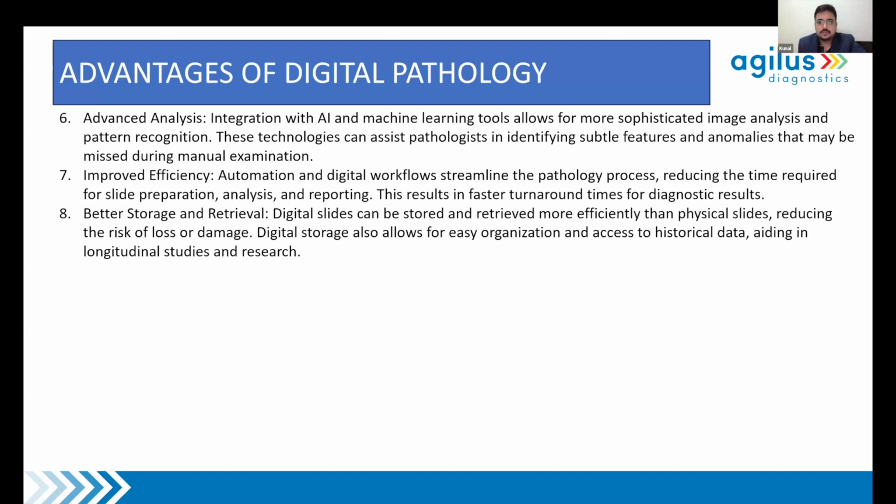What that also does is that it alleviates or mitigates the time that goes in logistics. Also, reprocessing. Every time you take an opinion from a pathologist, they have to reprocess the tissue. And we know that in oncology, tissue is the issue. You have a lot of molecular tests that you need to do. There are companion diagnostic tests that are needed. So every time you process this block, it ensues tissue depletion. So digital pathology is something that also helps you a lot in mitigating that.